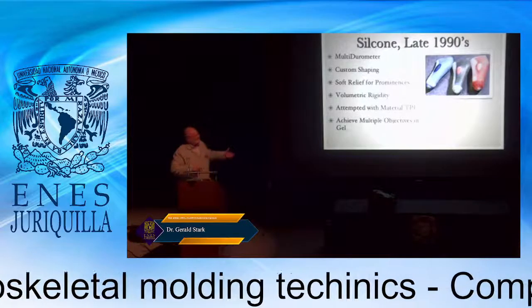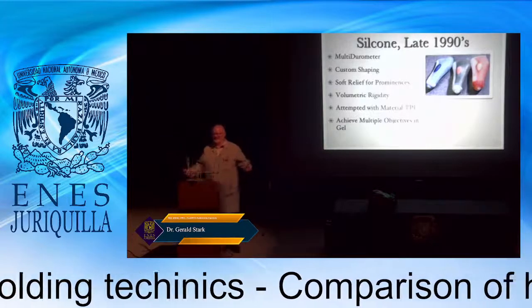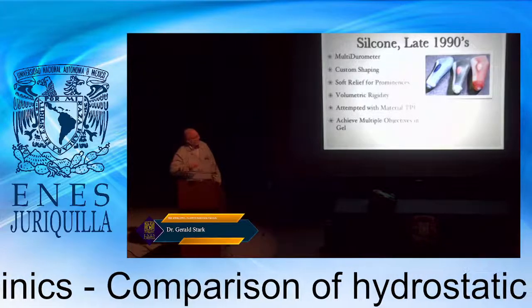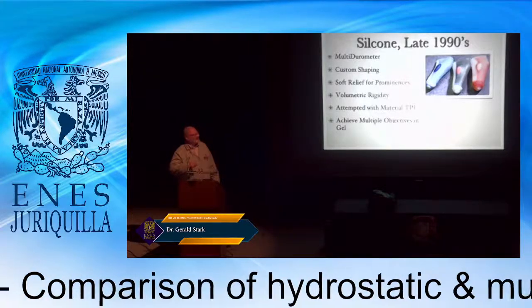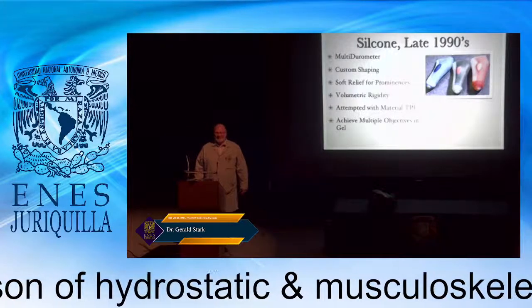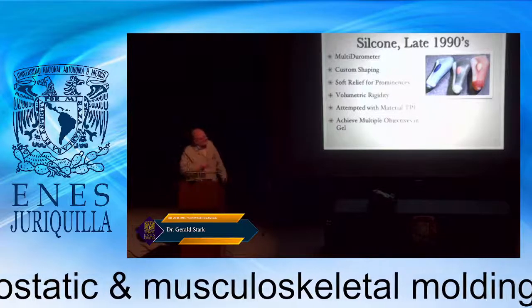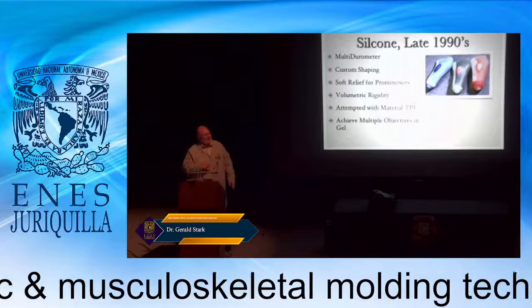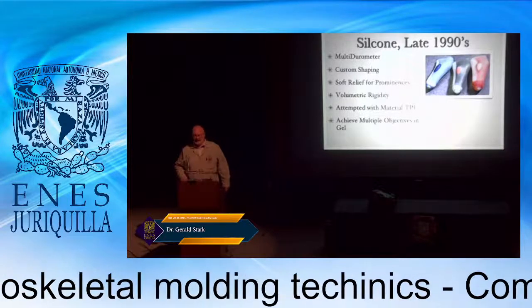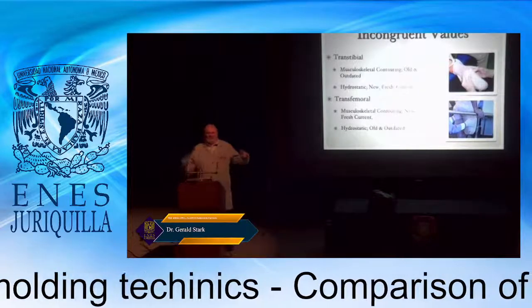And so we have other options, multi-durometer custom silicones, but there's always a downside there too. You see, we're surrounded by challenges. These are about 5 times more expensive, and it depends on the prosthetist's own creativity to make them better. Some prosthetists are more creative than others in addressing loading, but they have to do 2 things: provide comfort for the fibular head, see this, and rigidity in the distal area. So we have so many of these incongruent values, right?